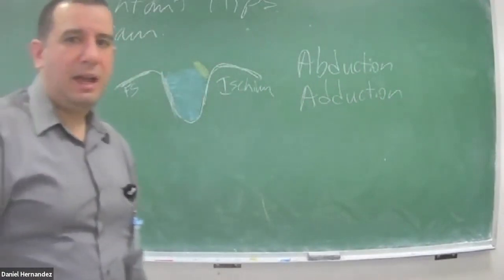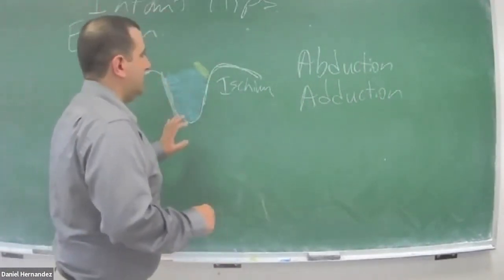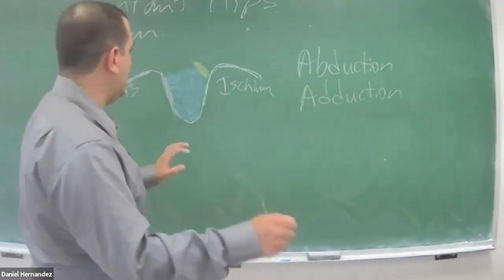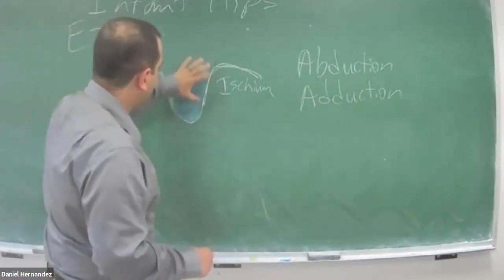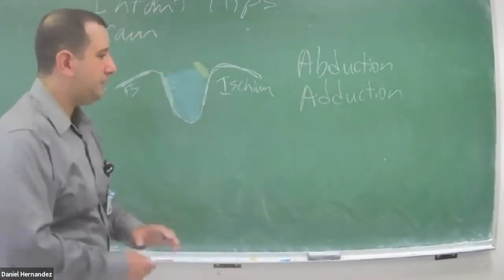Some labs will actually have you do a cine clip while you're stressing. So when you're rotating the hip outward and inward, you're looking to see if this hip shifts out and up out of this groove.